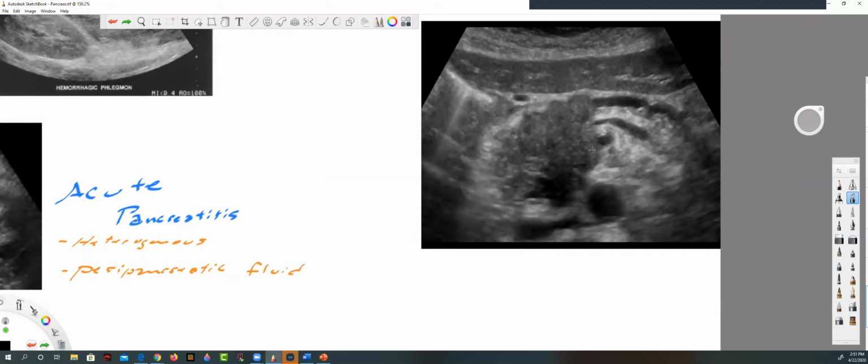But when there's more separation than expected, that tells me there's something in here. Perhaps the uncinate process, or perhaps just part of the tumor has grown in between these two. Anyway, what is this here though? So one of the things, it's very confusing. I'll just tell you right now, I don't know if that's what we're looking at.